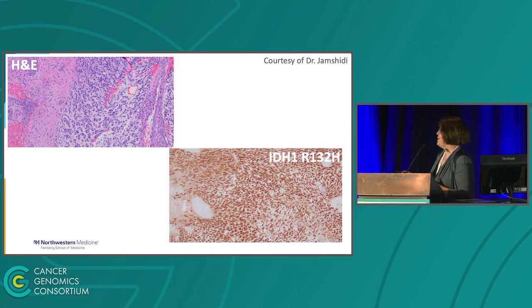Luckily, in this case, copy number assessment is very helpful. So you see what you see. This is a plot for OncoScan, and it clearly shows that we are dealing with a tetraploid genome. And I do not show the full complexity of data, but the copy number profile was very significant.